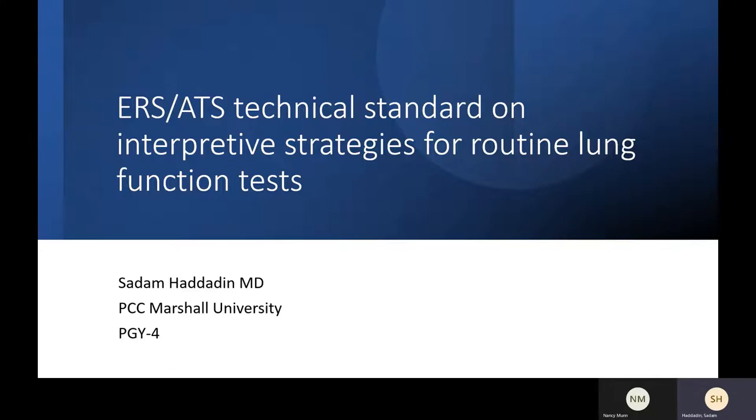So bronchodilator response was the only criterion. They were looking at the absolute or the relative change, like an absolute 200 cc difference in FEV1 or the VC. The relative change is the percentage; we use 12%. But the only criteria they were using were the initial, the pre and the post FEV1 or FVC, without looking at the predicted value. So the new criteria say no, we have to look at the predicted value, because all this initial value, FEV1, FVC, is related to the age and size of the patient with that predicted value.